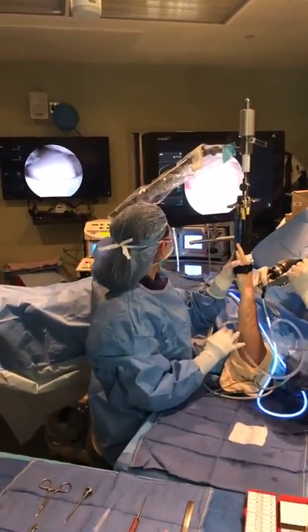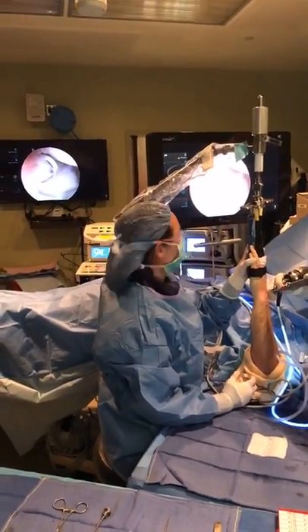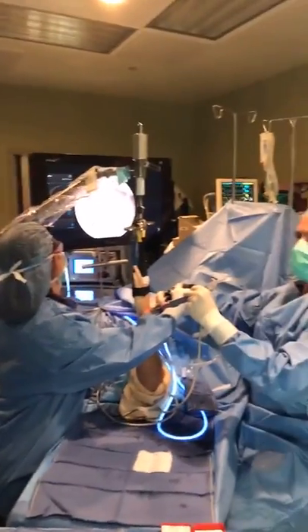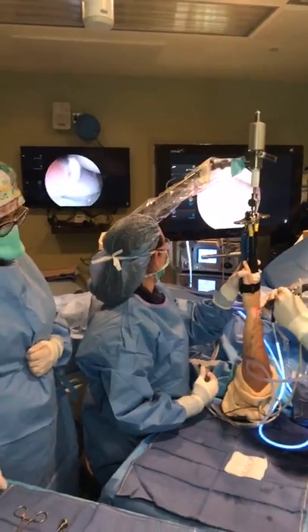This looks really good. Now, what doesn't look great is this. All that red stuff, that is not good. That means this guy's been dealing with inflammation in the wrist for quite some time. So we're going to remove that.